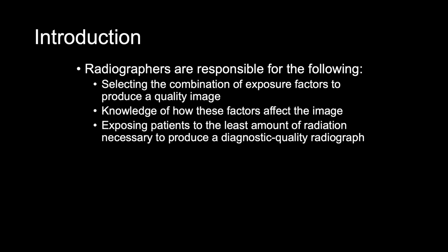So we need to know about exposing patients to the least amount of radiation necessary to produce a diagnostic quality radiograph. And that is where ALARA will play in, as low as reasonably achievable. So we want to give patients the least amount of radiation, but we need to give the image enough radiation to be able to give us a diagnostic quality radiograph.